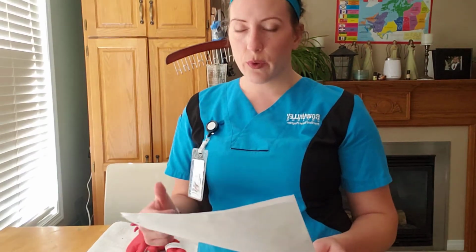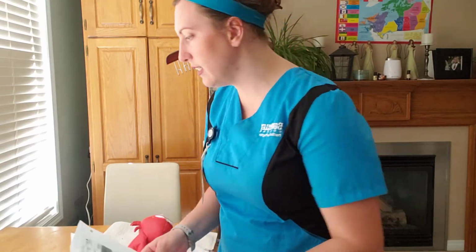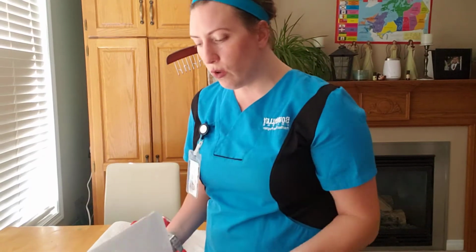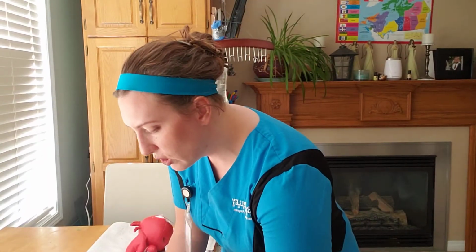There are some indications here for other reasons why you might get this medication, but I'm just going to stick to the prophylaxis here. The administration can be either direct IV, intermittent infusion, continuous infusion, or intramuscular injection. So we're going to focus today on intermittent infusion, which is what the IVPB is. For that indication, we're going to dilute the medication in 25 to 100 mLs of IV fluid and infuse over 15 to 20 minutes. So I'm going to use my scenario for my med math, and I know right now that it's going to be over 20 minutes.